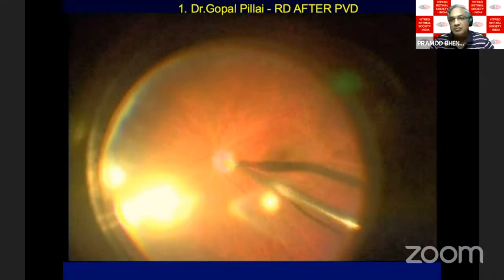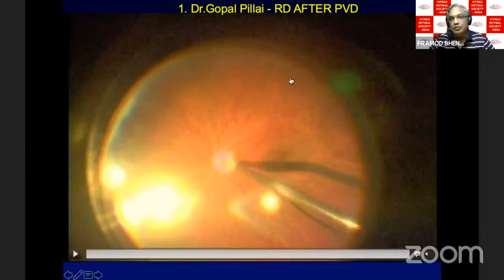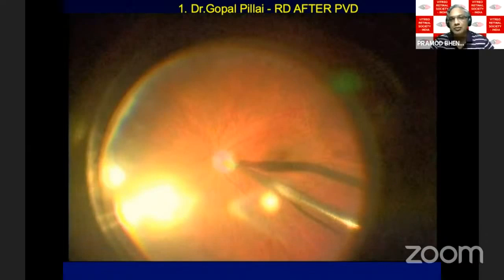The posterior border sometimes, with age, migrates posteriorly from the ora. What we know is around 2 millimeters, but not exactly 2 millimeters. It advances posteriorly as age advances and is always a ragged edge, not a uniform line. And when you induce the PVD with suction, you need to separate the posterior hyaloid, and during that suction, that ragged border can give you uneven traction along that edge, and typically those tears seem to be like that. That is because of, I would say, posterior migration. So you have to understand that concept, you have to understand that term, and you have to be careful.